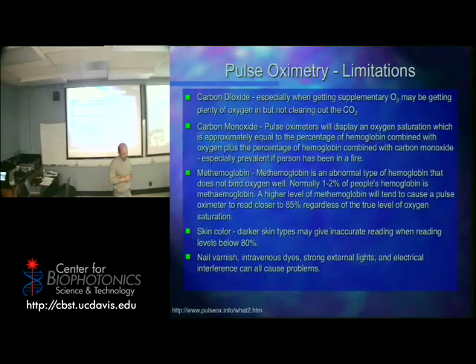Well, if you're running out of breath, it means your body is saying you have too much CO2 here and need more oxygen, not that there's no oxygen here. So you're asking how the body itself responds physiologically? I think the body looks at the CO2 concentration. So why wouldn't we create a device that measures CO2? Ideally, you would want to measure both, right?